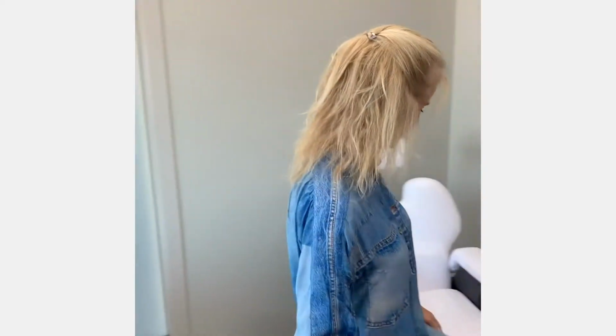Today I'd like to demonstrate two different ways to take a George Gage bite. This is Mary. She is our patient today. Mary has recently tested positive for obstructive sleep apnea and has elected to treat this condition with an oral appliance.